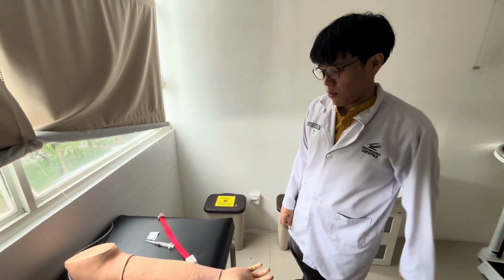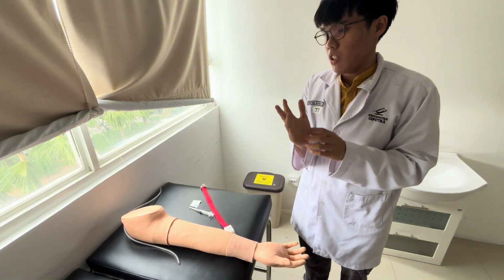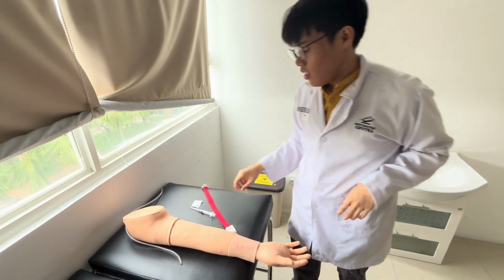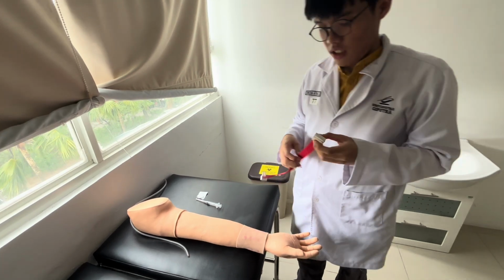Okay, so first I will apply gloves. So let's pretend there's gloves here. Just make sure to use sterile gloves. And then first I will apply a tourniquet on the patient.